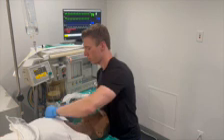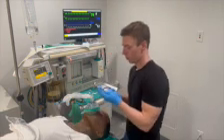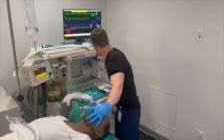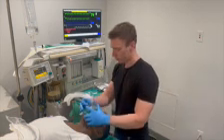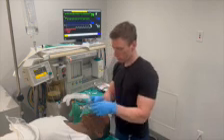To check for consciousness, call out the patient's name. If there is no response, check the eyelids for the lash reflex. With no response, tape the eyes closed with the tape from the mask and begin to ventilate. To counteract propofol's quick redistribution time, many providers will turn on an anesthetic gas while they are ventilating the patient to ensure adequate anesthetic depth.